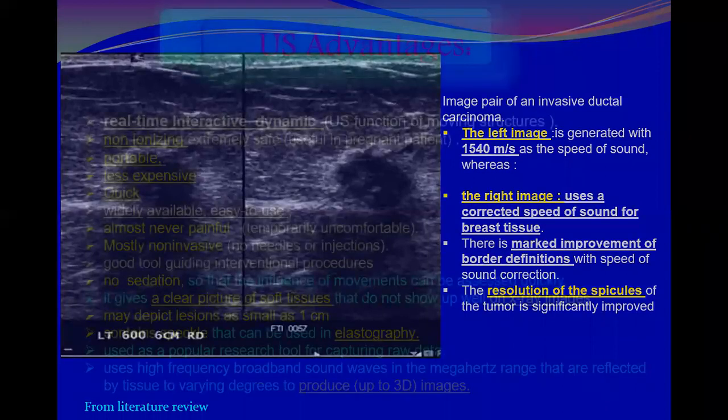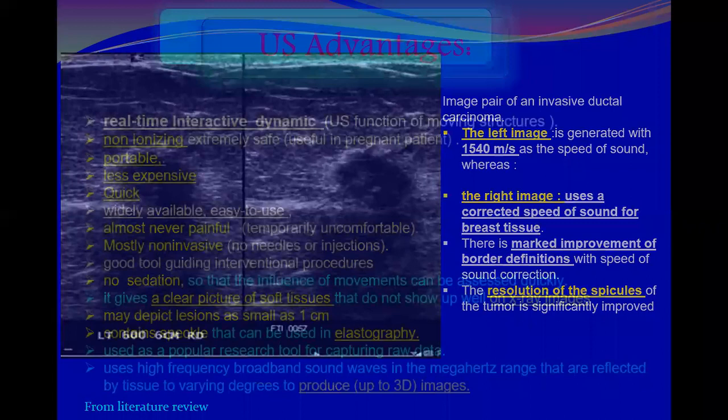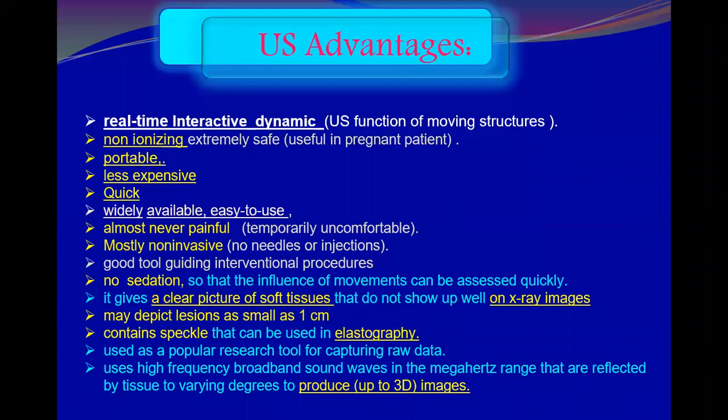Okay, we have almost gone through the ultrasound modern facilities, and let us go to the next step. What are the ultrasound advantages? As you know, there are many advantages.